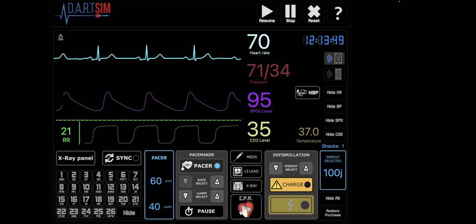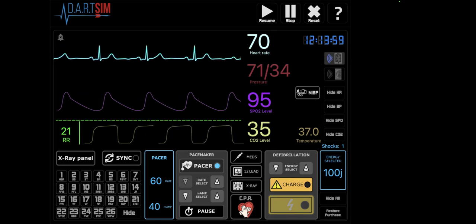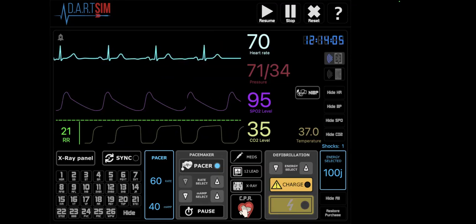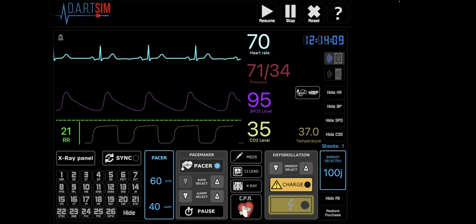If the patient's heart rate were to drop to 60 or below, then the pacemaker would kick back in, and that is called demand pacing. So an external pacemaker is a VVI pacemaker. All it does is pace the ventricle, but that will give you some cardiac output.